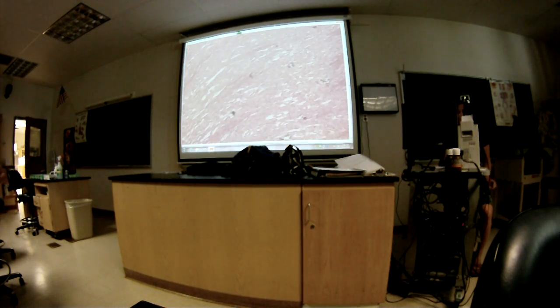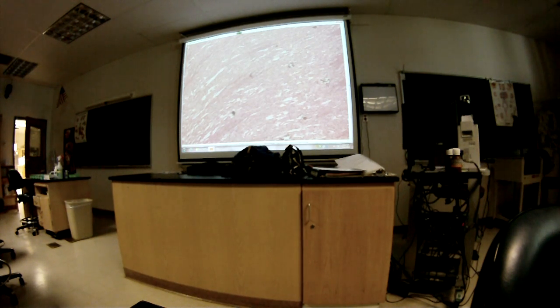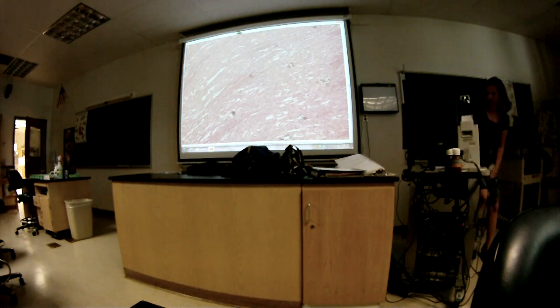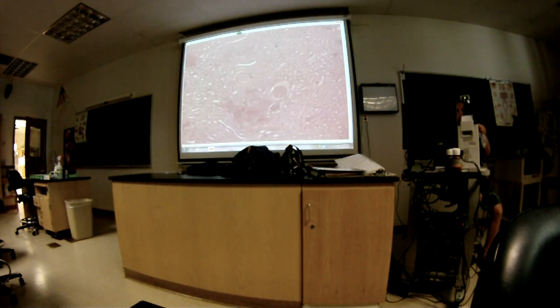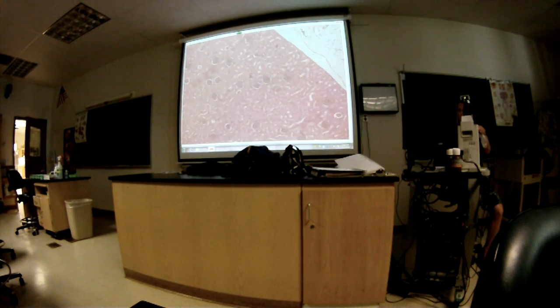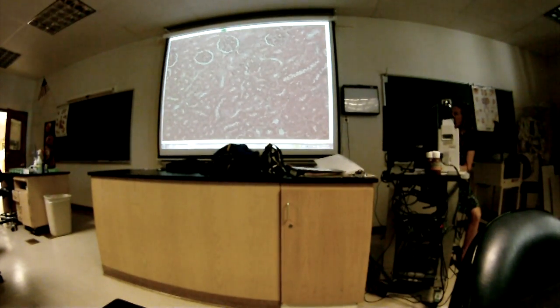There's another totally different view. And then over here, go 1 magnification up. And the question is name the organ.